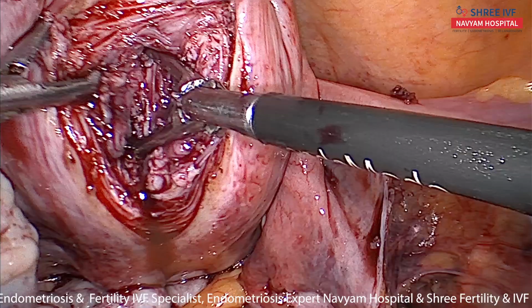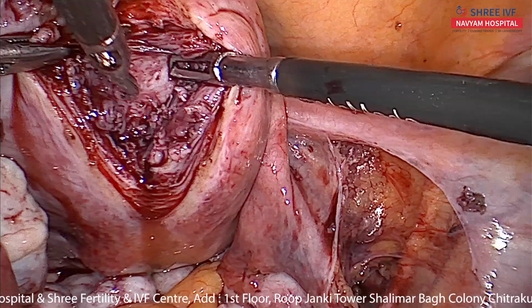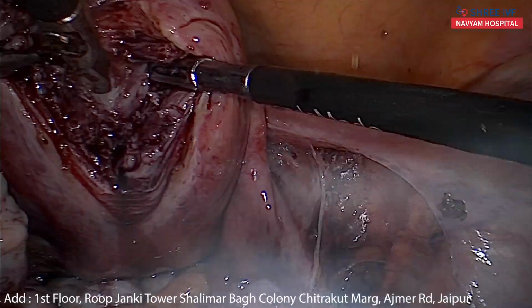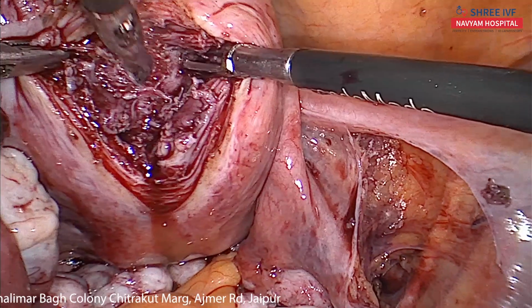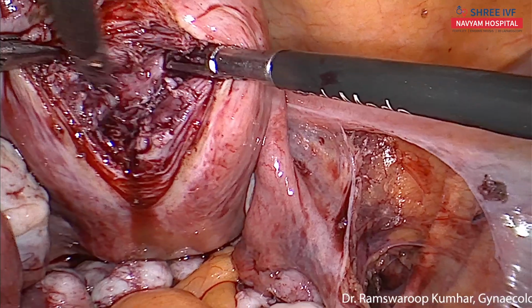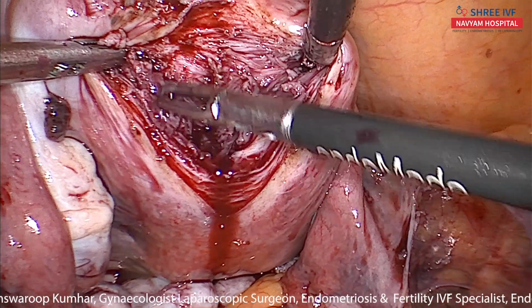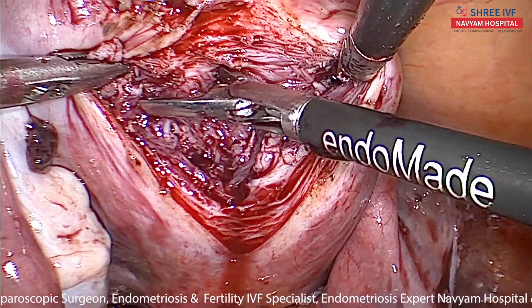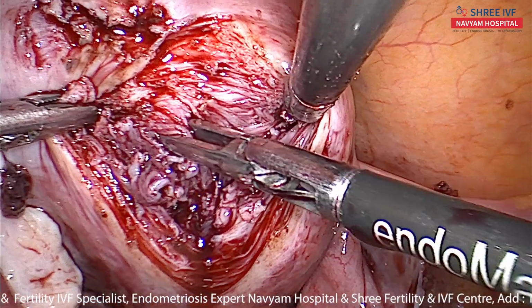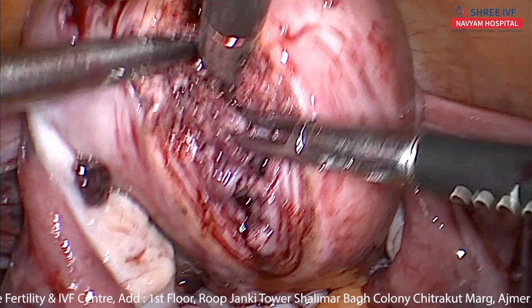Where is this one? Okay, hold it. We'll give some incision here. Endometrial cavity or myoma? Locus is telling this is the myoma. No, no, this is the cavity, I think.